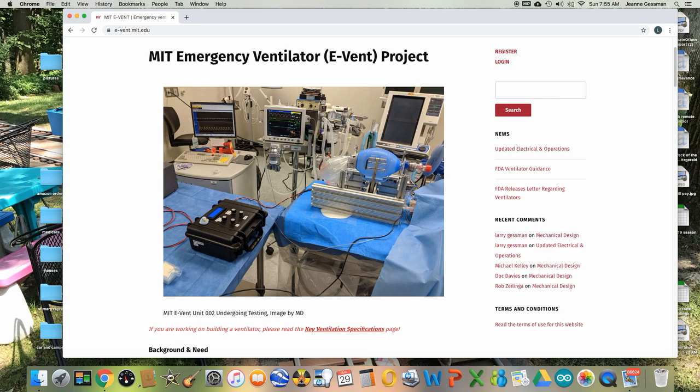Hello, my name is Larry Gessman. I'm a physician and electrical engineer, now retired, but I'm trying to help other engineers design a simple ventilator for the COVID emergency.